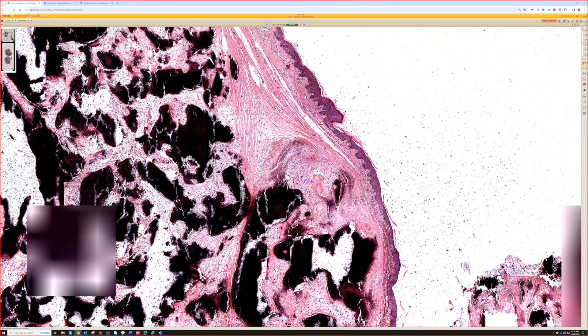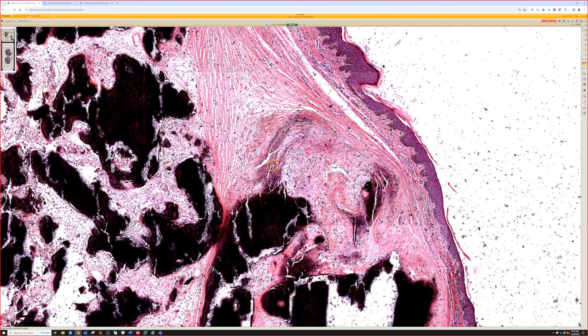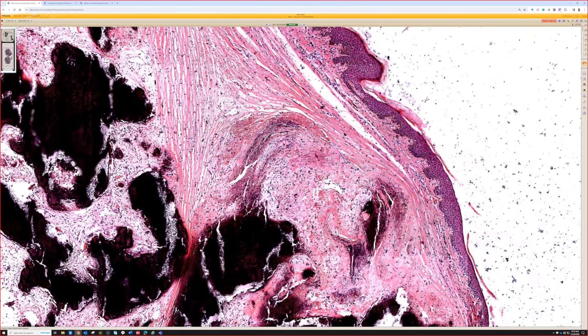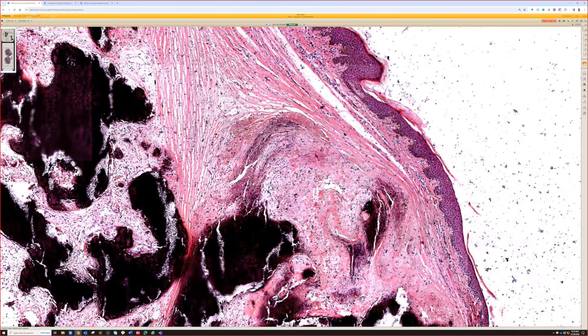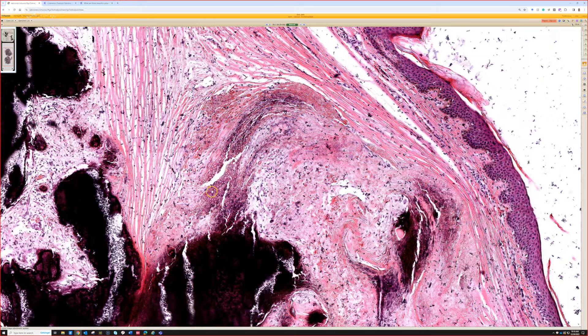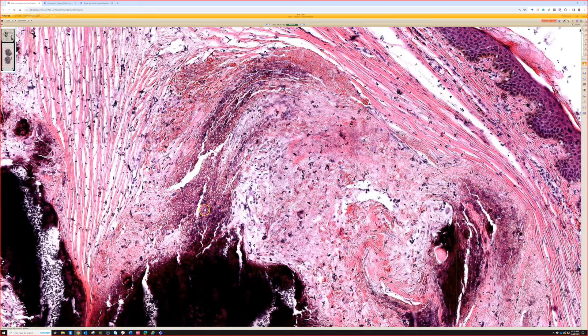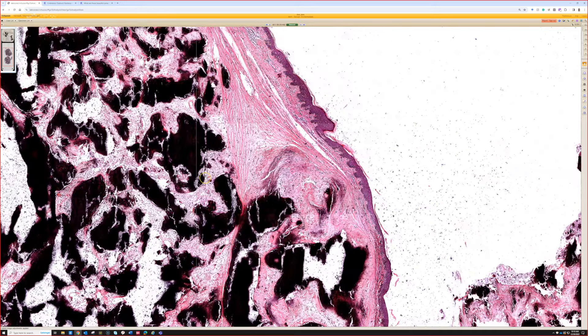If it's a solitary nodule, it would probably not be the end of the world honestly. It wouldn't be a major treatment difference for the patient. It's benign either way. But just for testing purposes, so you know, finding those ghost cells even if they're focal, that's the clue to tell you you're dealing with a pilomatrixoma with extensive calcification rather than calcinosis cutis.